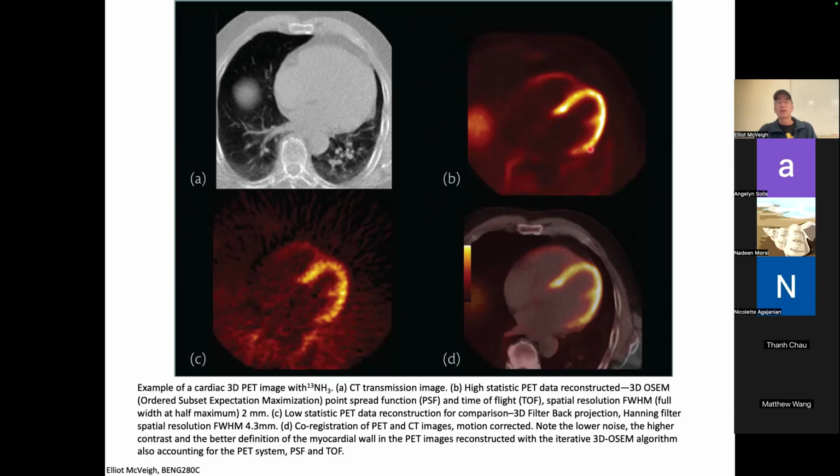So here's our model image, and this shows that there really isn't a huge variation at this frequency. Then you can take this model, which tells you what's the flow as a function of position or pixel, and map it on top of the CT so that you have context as to where that is in the patient, right?